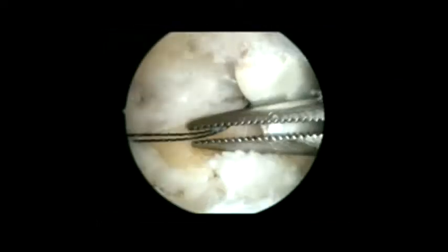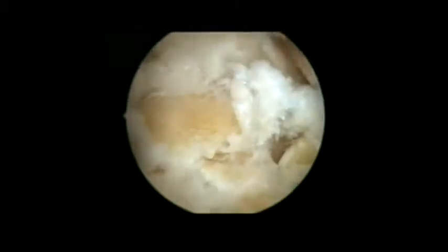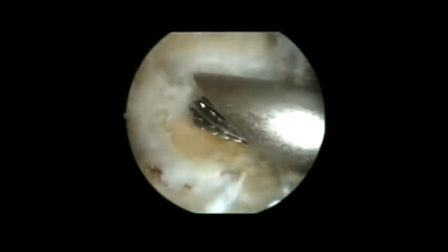Proximally, the tibiotalar joint is visible. We pass a nitinol wire in order to loop a nylon structure around the tendon, to mark it, retract it, and avoid injury. This is an important step to protect both the flexor hallucis longus tendon and the neurovascular structures. We must be extremely careful when preparing the joint.